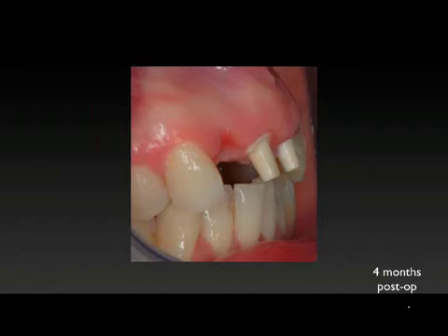We don't want to put the implant in where the bone is. We want to build the bone. We want to idealize the site before we go in there and place the implant, because that's going to give us long-term success. And at the same time, this is the reason why, in the right cases, if our case selection is correct, angulation is not something I worry about.